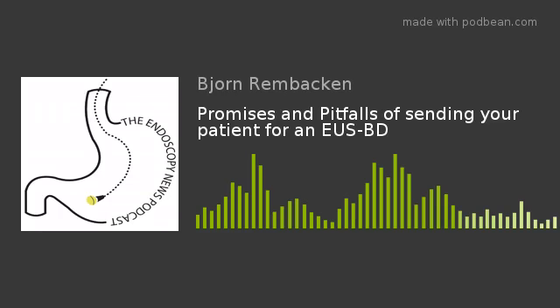In this podcast, we will be talking about endoscopic ultrasound guided biliary drainage. Now, we all know that ERCP is widely used in current practice to drain the biliary system. And in cases of failed ERCP, percutaneous transhepatic biliary drainage, that is PTC, or even surgical interventions have conventionally been used. However, nearly 20 years ago, in 2001, Giovannini and colleagues first described the use of endoscopic ultrasound-guided biliary drainage, and since then, this technique has gathered immense momentum.